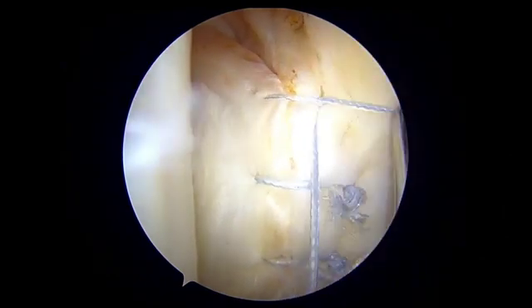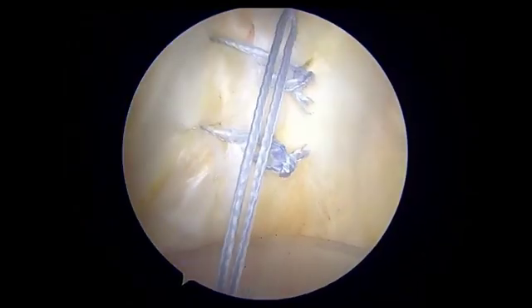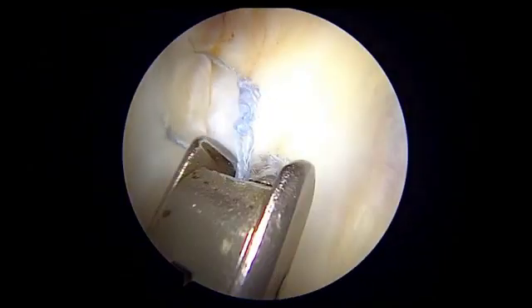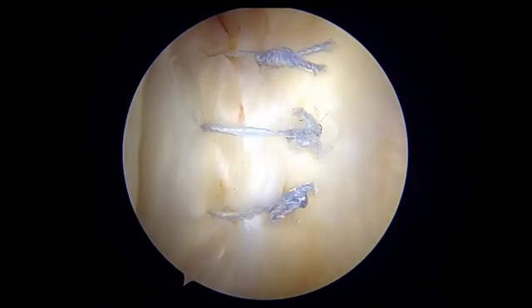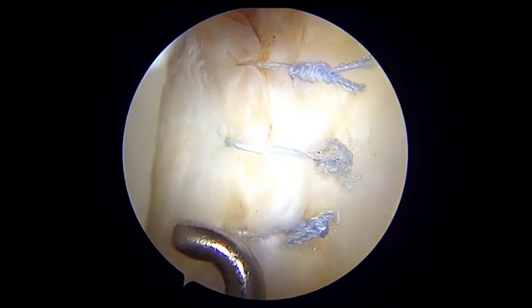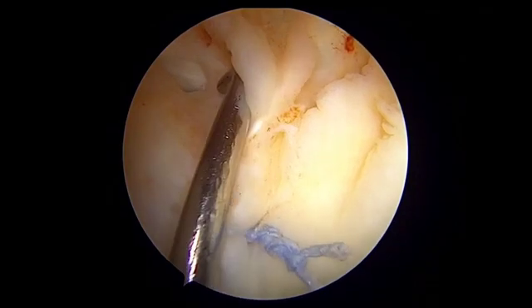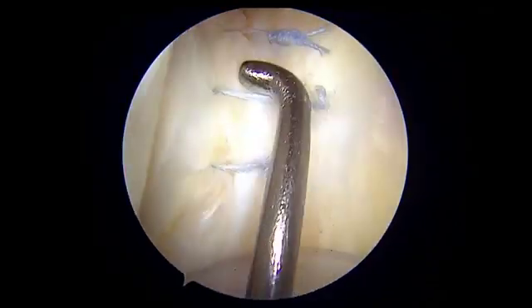The alternate half hitches are tied. Looking from the high posteromedial portal, a very well-achieved closure is visible. This technique is quite simple and everything is under vision. On probing, the whole ramp lesion is quite stable and fixed very well.